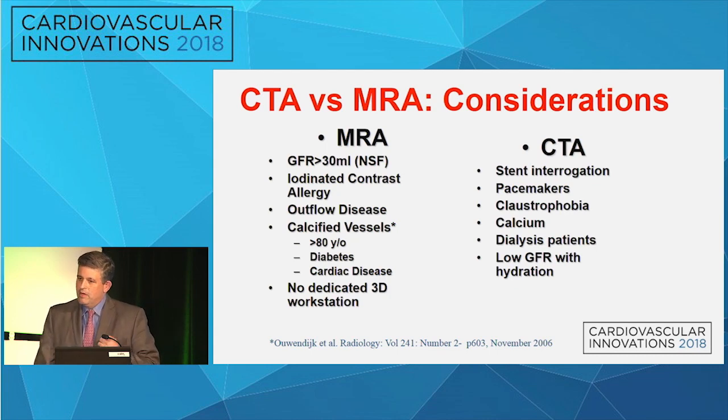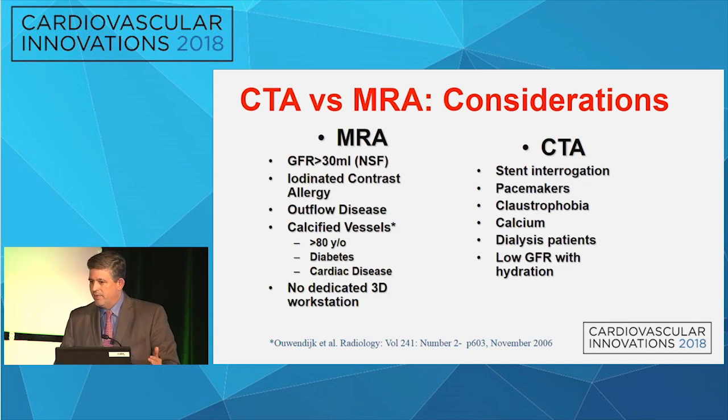CTA, I reserve really for evaluations of inflow lesions, patients that may have stents or pacemakers or contraindications to MRA. So these are the patients that I go with CTA, particularly if they're able to tolerate the contrast. Dialysis patients can't get an MRA, but they can get a CTA.